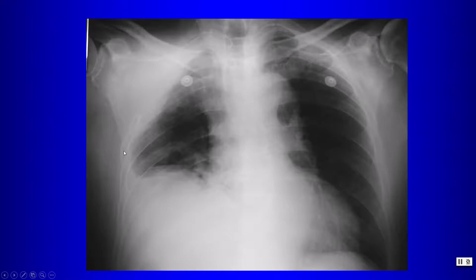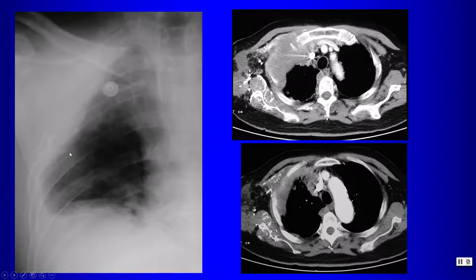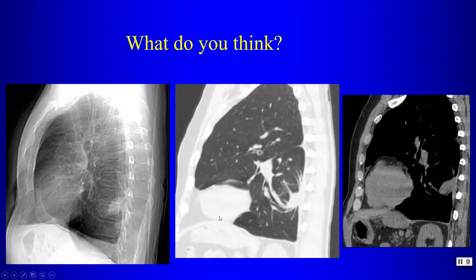It looks like it is actually making this lung smaller than the other side. So when we see that kind of circumferential diffuse pleural thickening, we need to think about neoplasm. This is mesothelioma, which can also be associated with asbestos exposure. And here we see that large pleural mass and pleural thickening extending to the mediastinal pleural surface. And this one is actually invading the chest wall.